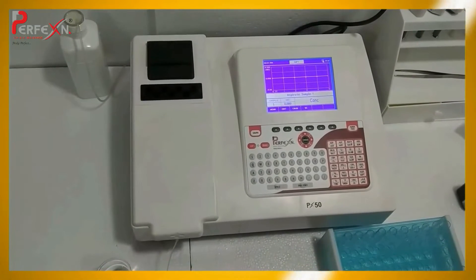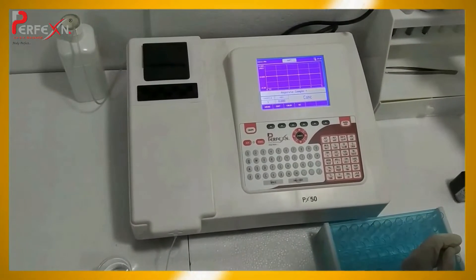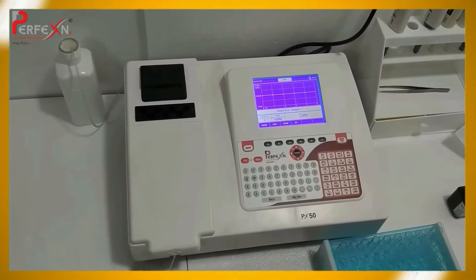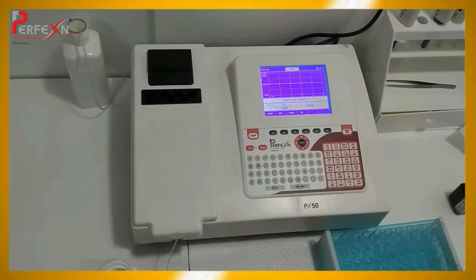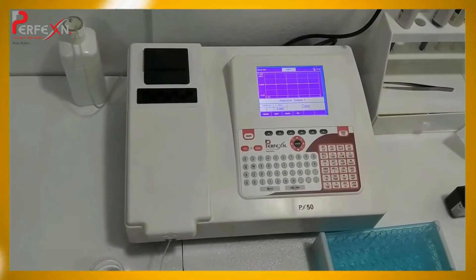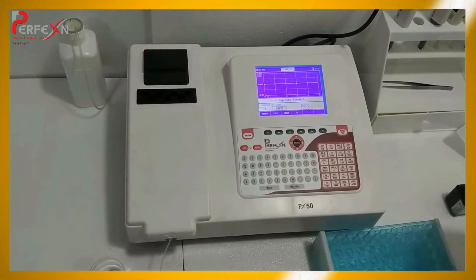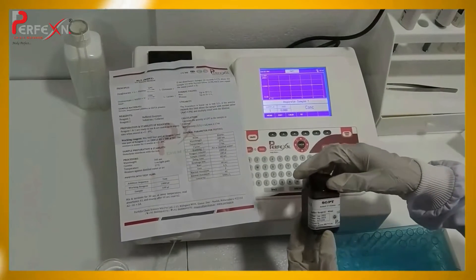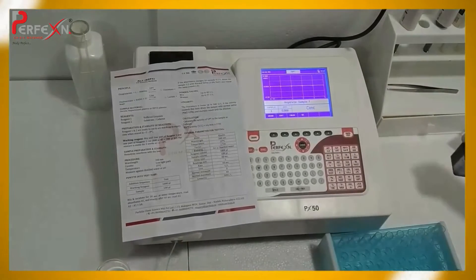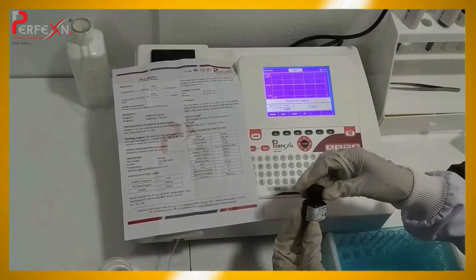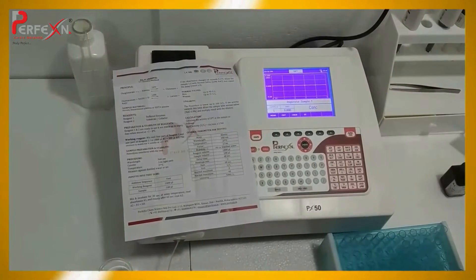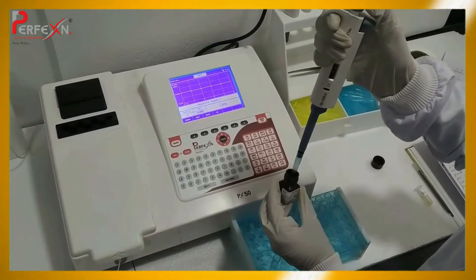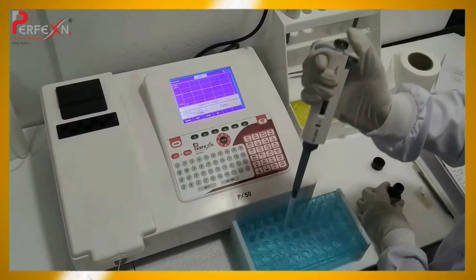Now we will dose it for the test. I am performing the test in the half ratio, so I have to adjust to 500 microlitres. The ratio of reagents is 4 to 1. On the literature, you will see the working solution to prepare: reagent R1 is the buffer reagent taken in 4 parts, and R2 is the substrate taken in 1 part. In the same test tube, take R2 — that is 100 microlitres — without air bubbles.